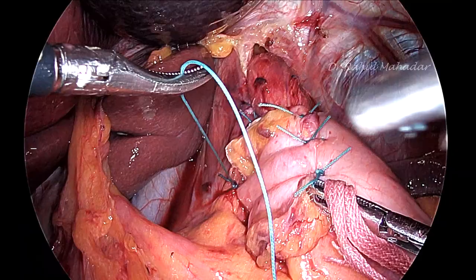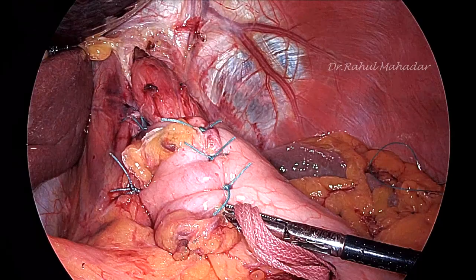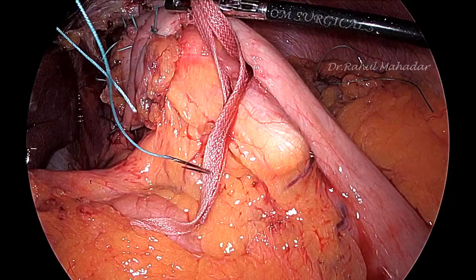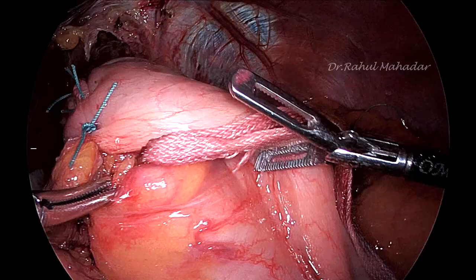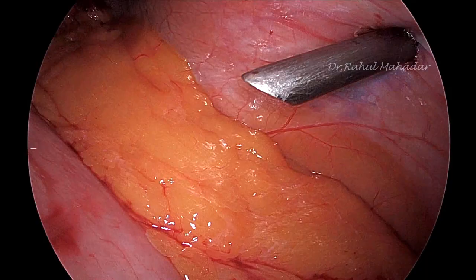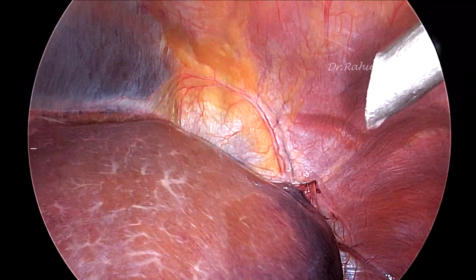So now almost procedure is done. So suction is done. And ask the anesthetist to put a Ryle's tube. And then the umbilical tape at the OG junction level is taken out and removed. So this is now the final picture. Under visualization, we remove the Nathanson's retractor. See, there is no bleeding.